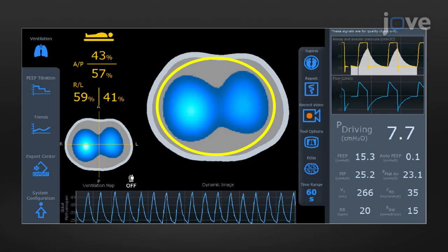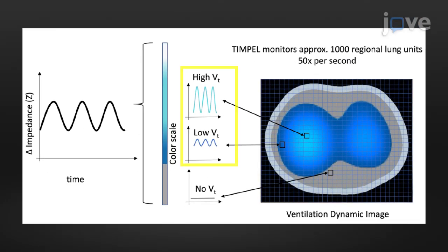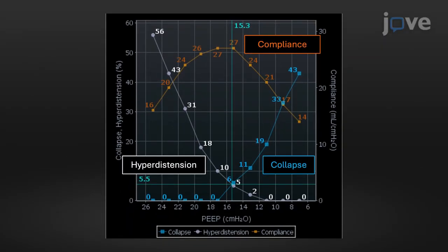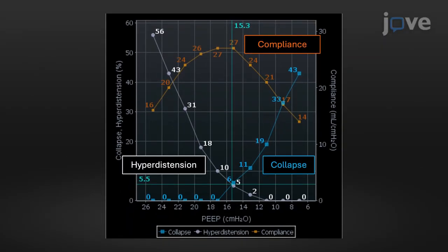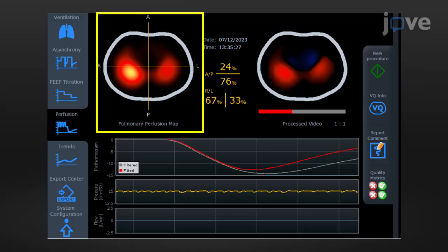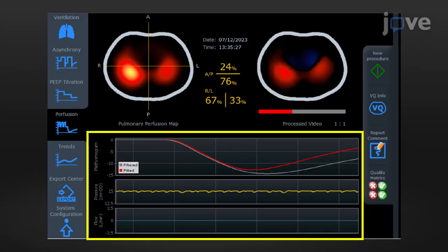Dynamic imaging displays real-time air distribution changes during ventilation, using color variations from dark blue to white to show least to most ventilated areas, with gray indicating no change. EIT technology allows real-time monitoring of lung mechanics, presenting data on lung area responsiveness. EIT also extends to measuring pulmonary perfusion with the detection of changes in blood impedance, especially using intravenous hypertonic saline during specific maneuvers. This helps to visualize and assess perfusion patterns alongside ventilation.